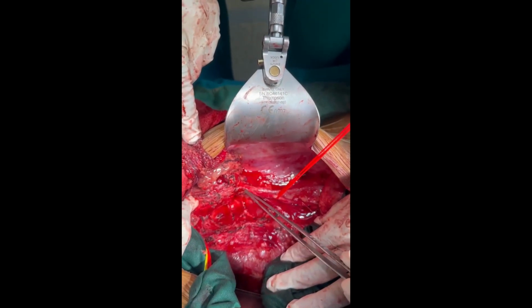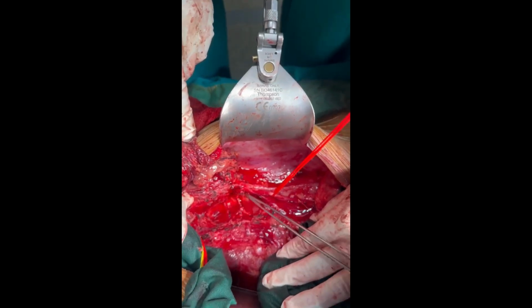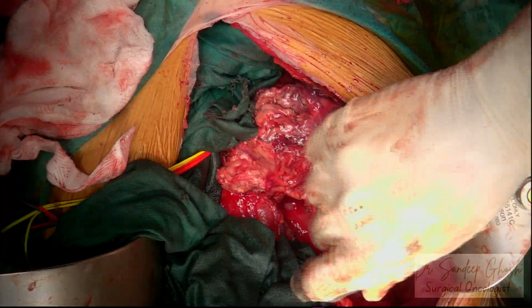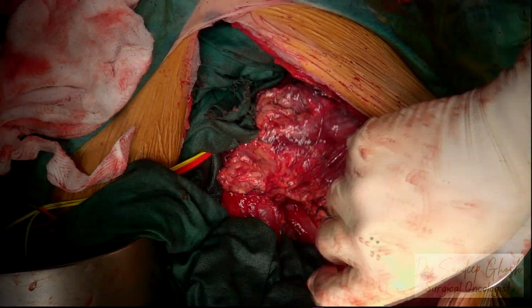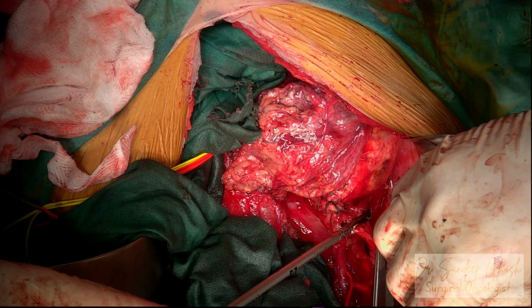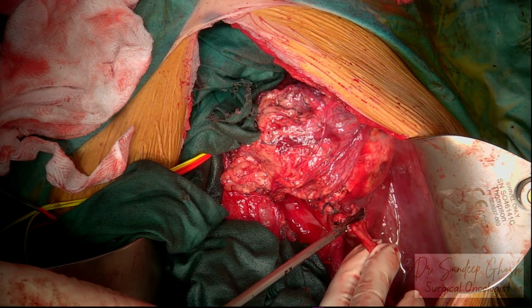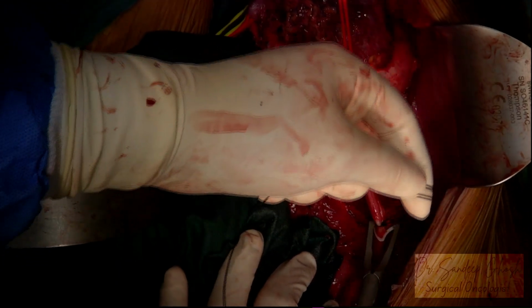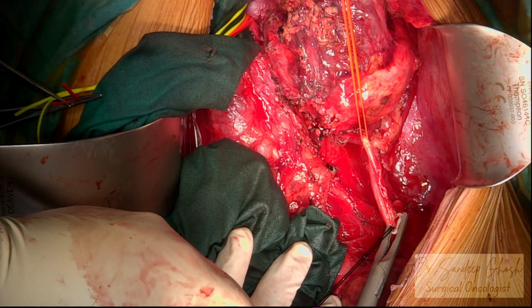Now the loop is the ureter. You can see the ureter clearly going through the tumor. That is, it is encased by the tumor. So we have made a decision to go ahead with the left nephrectomy en bloc with the removal of the tumor. That is the gonadal vessels being tied and ligated off. Now that is the ureter being tied and clipped and will be subsequently cut.